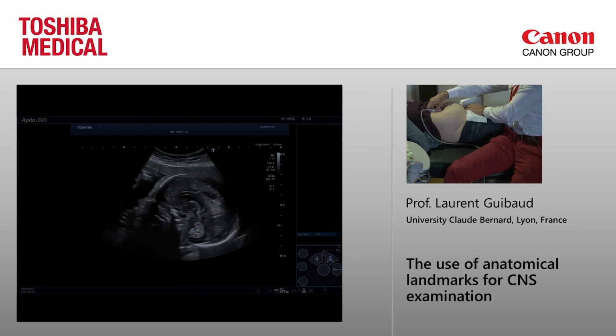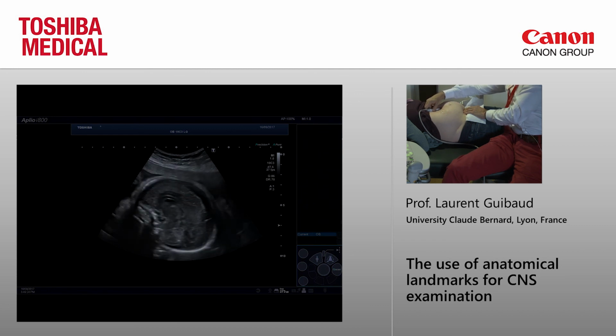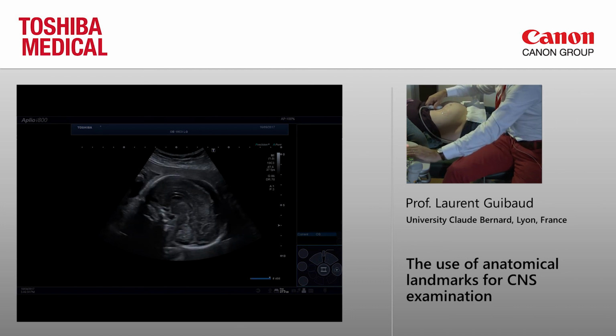To be sure that you are really in the middle, you should have the vermis and the nasal bone. So I'm not completely perfect, but almost. This is okay. And here you see clearly the cavum septum pellucidum here, and here the cavum vergae. Here you see the brainstem.